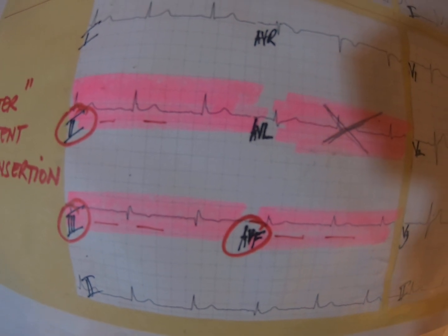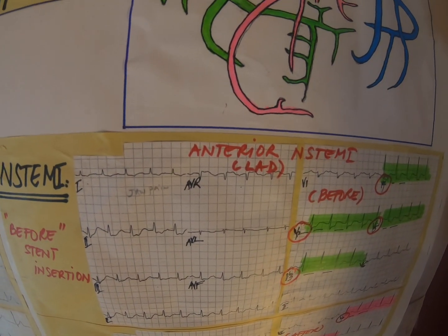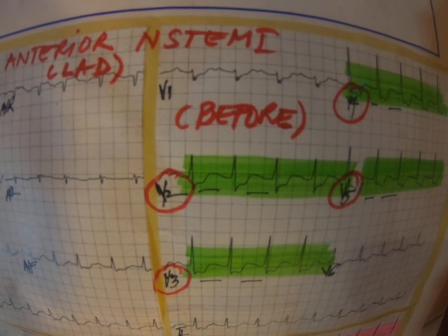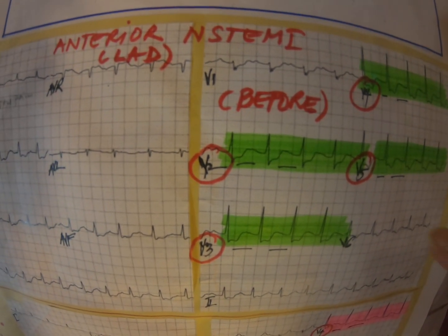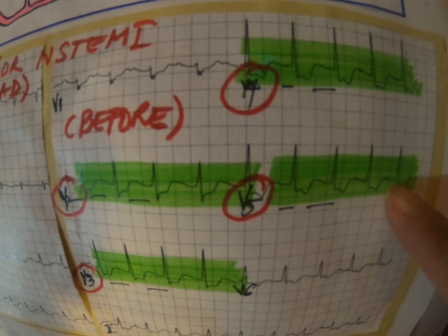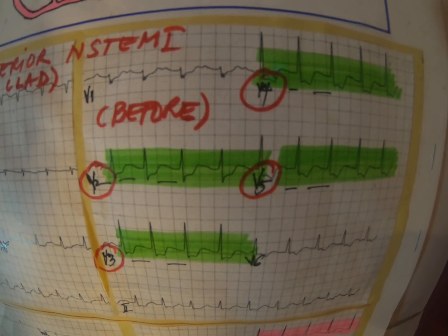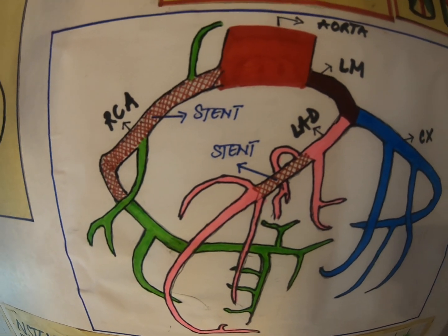We like this. So in the case of a non-STEMI, a patient came in to the emergency room or maybe called 911 for the same symptoms as the inferior. The ECG showed ST depression. So we have a subendocardial infarct, or MI. And the ST depressions are quite deep, in V2, V3, V4, and V5. And because of that constant pain, the decision is, okay, it's not ST elevation, but the pain continues. Let's bring the patient to the cath lab. So this is the decision of our cardiac interventionalists. They went in, and they saw this blockage in here.